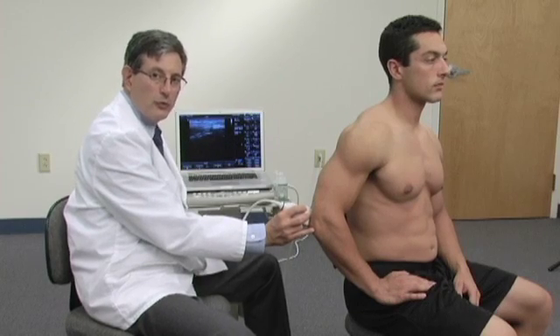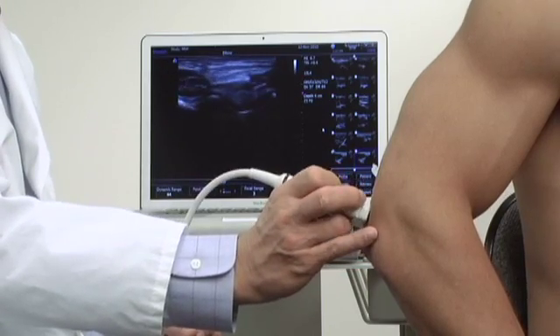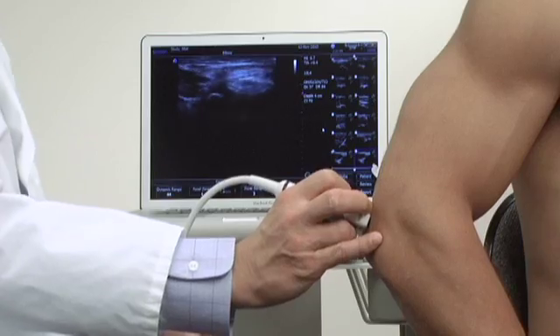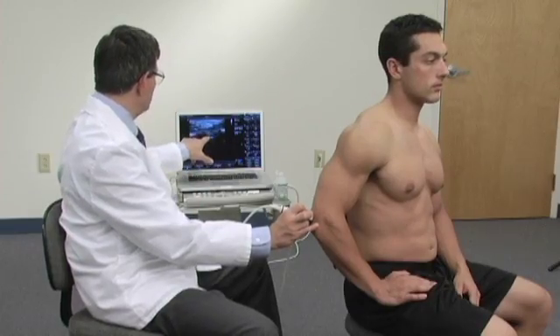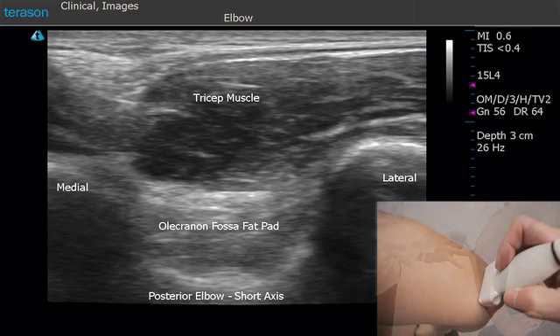From the longitudinal position we'll rotate the probe 90 degrees and look at the posterior elbow transversely. Here we can see the posterior fat pad again, which can be displaced by joint effusion.